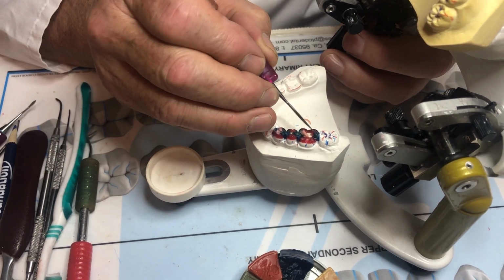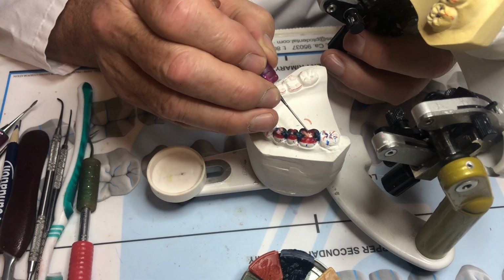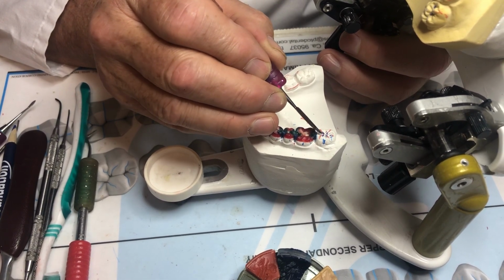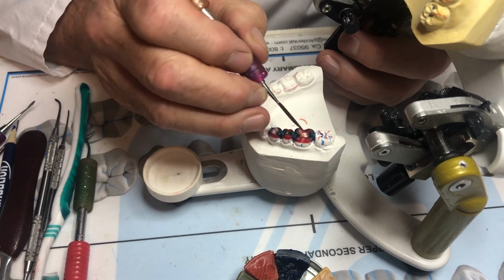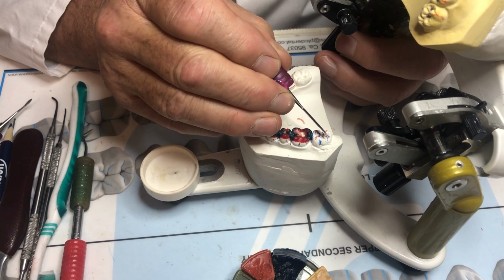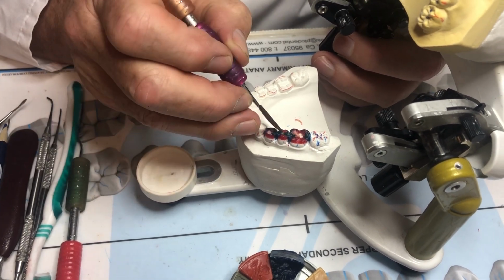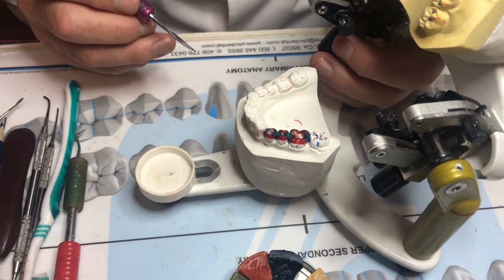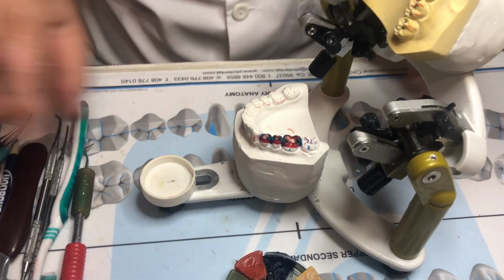Now I would go over to the other side. If you look at it, they're mirror images of each other, so I can do the same thing there. Then I can come to the mesiobuccal, I can do that one. Then I can come to the distobuccal cusp and do that. Then lastly, the little tiny one, distal cusp, all by itself in the corner. We can do that one last. Then we'll take our carving instrument, touch up the anatomy a little bit. That side's done.